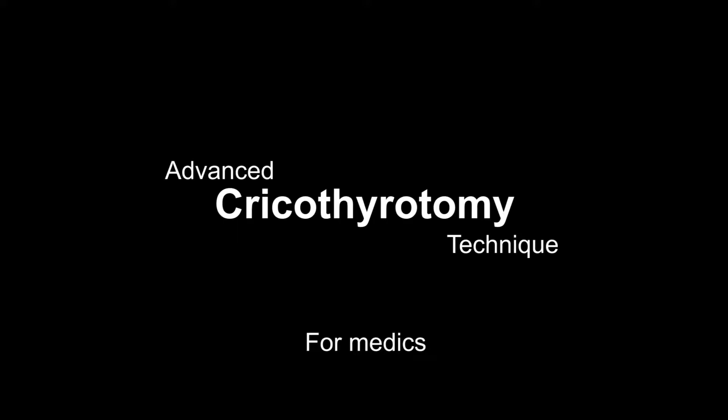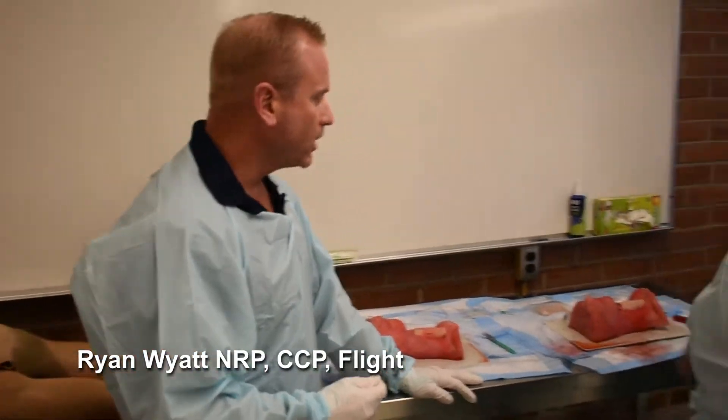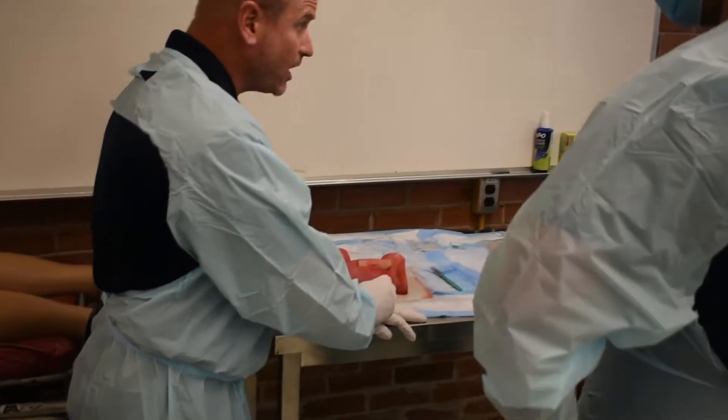This is surgical crike. Are you guys right-handed? As right-handed clinicians, you're always going to want to be on the right side of the patient. What does that mean? What's our target area when we surgically crike?